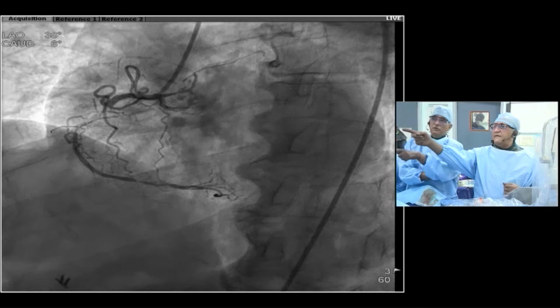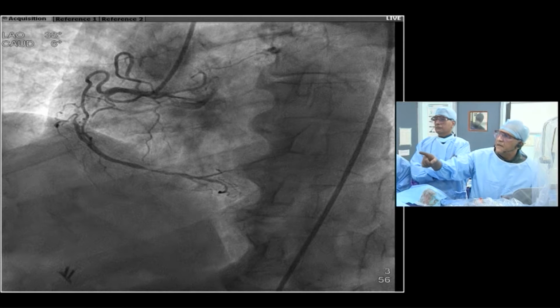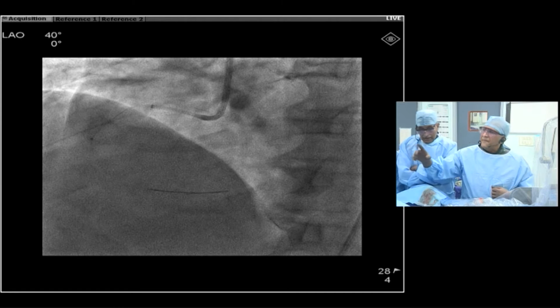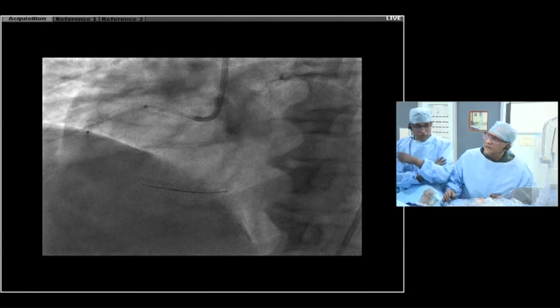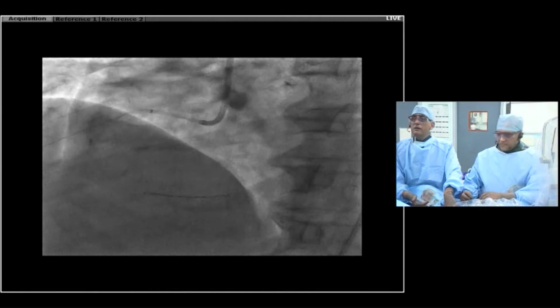Just turn that there, put that there, and see where my laser is. I think you're just at that tip, distal. Yeah, we're just at the distal cap. Just making sure that I'm absolutely certain. Yeah. Yeah, ready? Just one more. Yeah, inject.